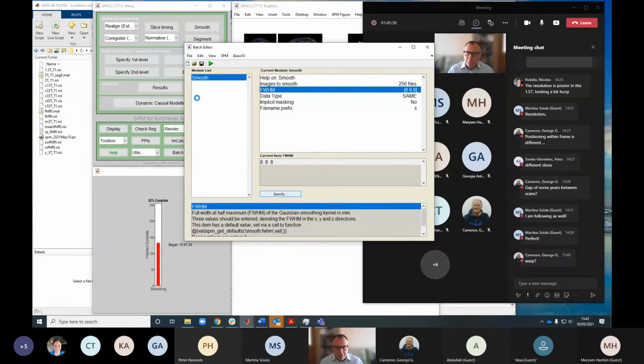You always want to minimize the number of write steps that you have in your pathway. Every time you write out a set of data, every time you apply an interpolation, you're losing information, I should say, not data. You're losing mostly high frequency spatial information, so the interpolation tends to smooth out sharp edges.